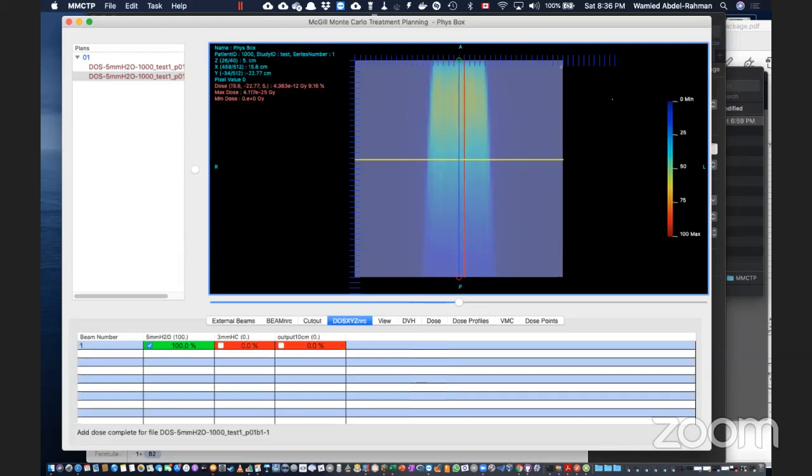I tried to actually import one of the radiation plans, but not all the images were getting imported. It was saying that there are some pixel problems. What's the radiation planning system? It's Elekta Monaco on Centra. You heard what Bilal said.